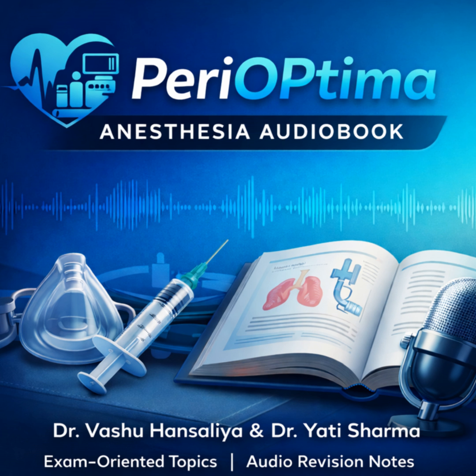Exactly. Now, the essential comparison for understanding clinical limitations, SGADs versus endotracheal intubation. The ETT. This distinction demonstrates your grasp of definitive airway control. The seal is the primary difference in both function and safety. Correct. The ETT provides a tracheal seal. It's definitive, and it offers maximal aspiration protection. SGDs, on the other hand, provide a periglottic seal, which is non-definitive. It relies on pressure and anatomy. And airway pressures.